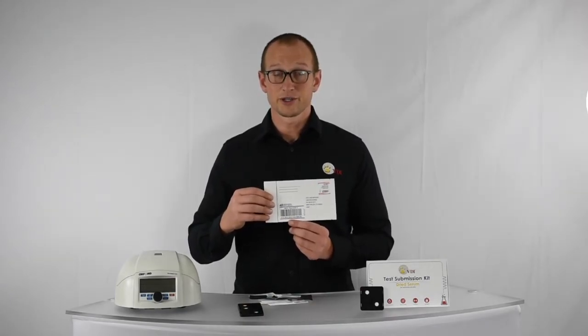You're now ready to mail. If you ordered kits with tracking, remember to record the tracking number. A quick photo from your cell phone works great too. And that's all there is to it.